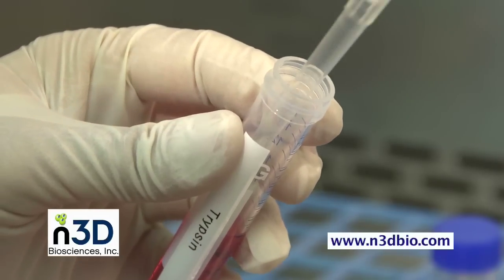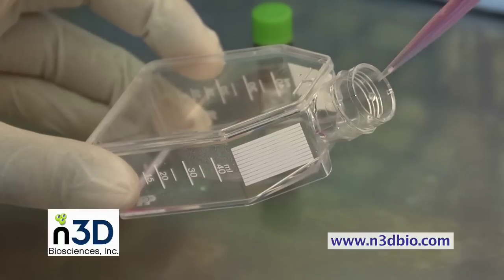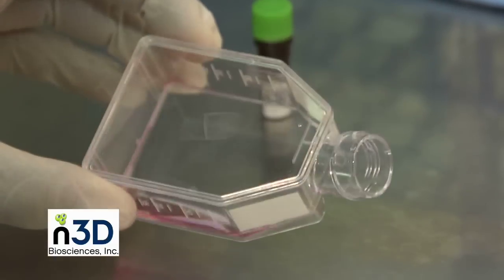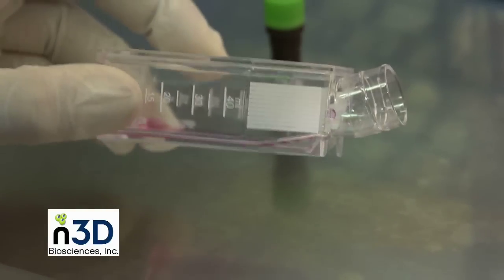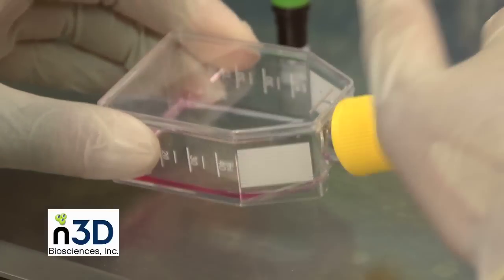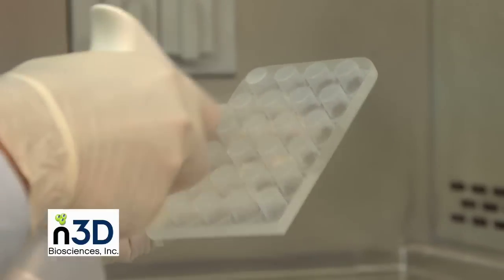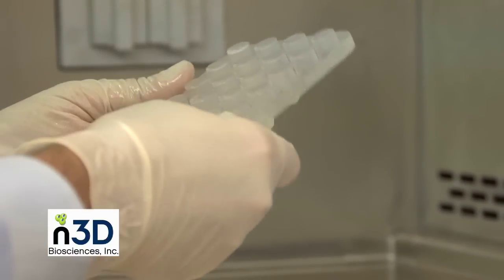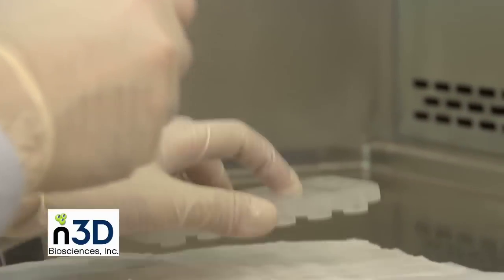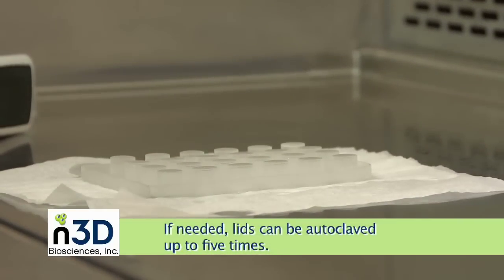Cells must now be detached from the flask. We recommend adding enough trypsin EDTA solution to cover the adhering cell layer. Since cell detachment protocols are cell type specific, we suggest following your lab's established protocol. While waiting for the cells to detach, clean the magnetic drives. If using the 24- or 96-well formats, clean the culture isolation lid with 70% ethanol and dry under sterile conditions. It is important that the lid is completely dry before placing the lid. If needed, the lids can also be autoclaved up to 5 times.